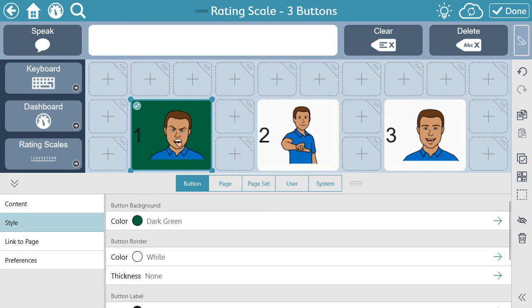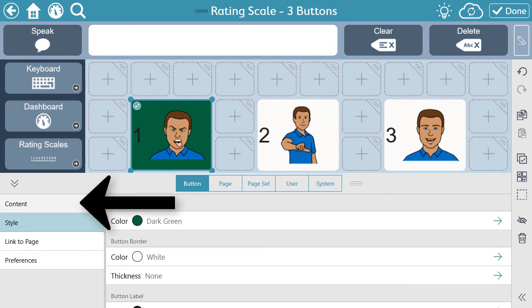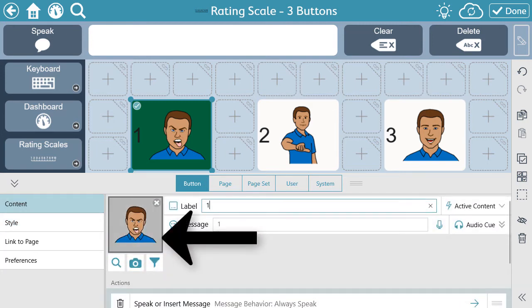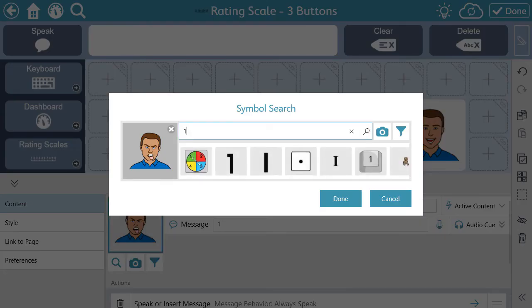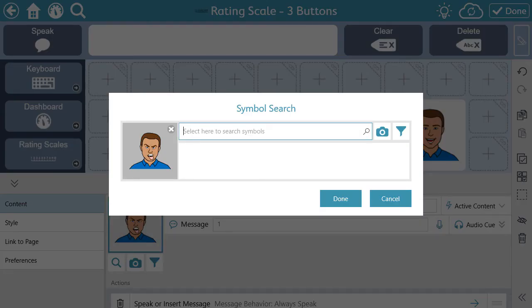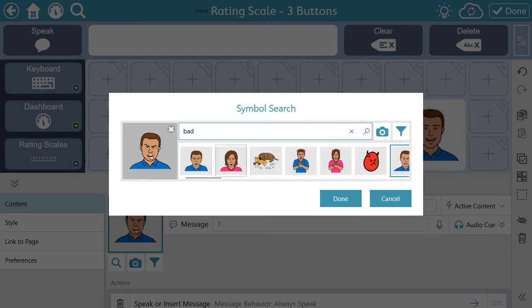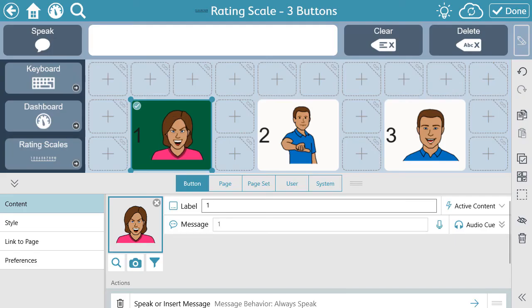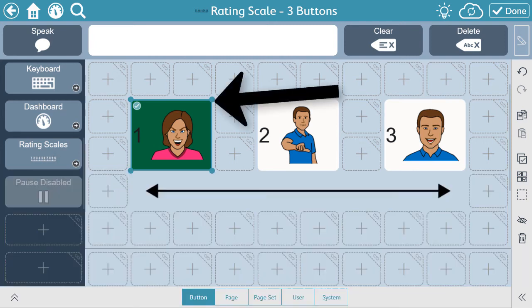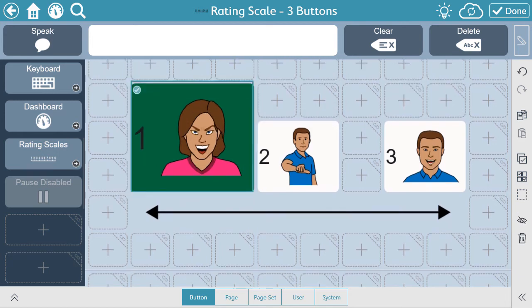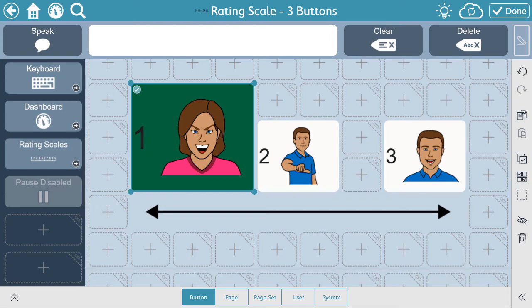You can add or change a symbol by searching the symbol options under Content, and here you can type a keyword or phrase for the symbol that you're looking for. Or you can add a personal photo. You can even change the size by selecting a point on the blue outline of the button and dragging it to be bigger or smaller. Then be sure to hit Done when you are finished.